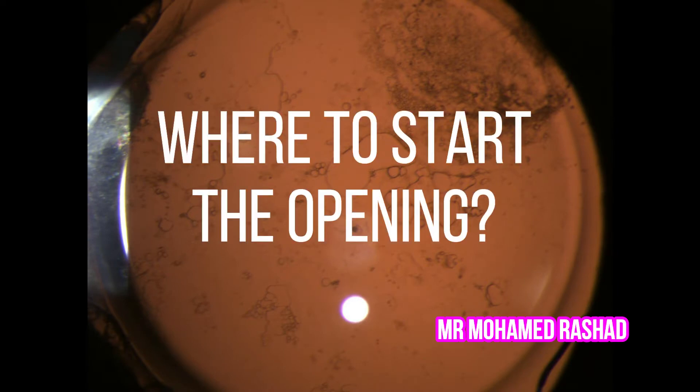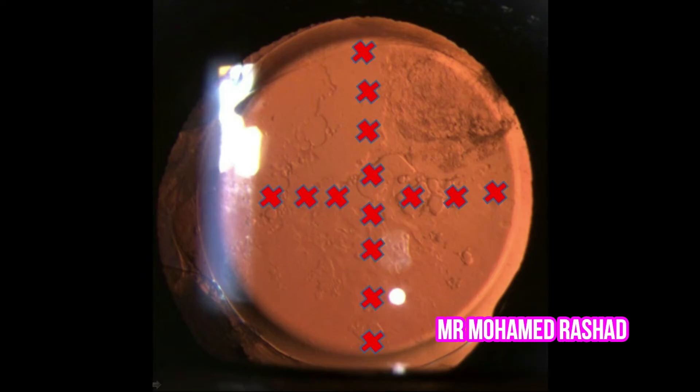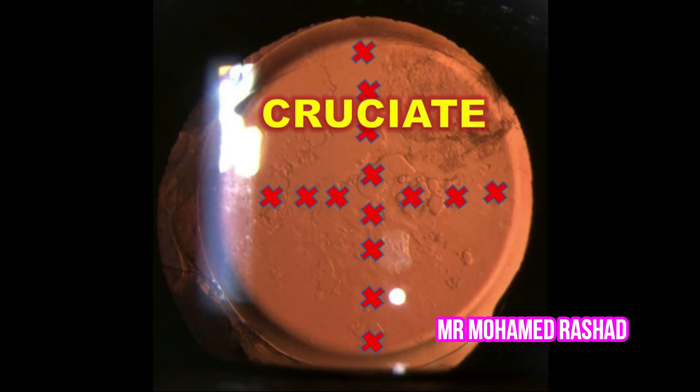In my opinion, the easiest way to do an opening in the posterior capsule is by doing a cruciate opening. You start at 12 o'clock and pull down to 6 o'clock, thereby avoiding pitting of the intraocular lens. This gives you an opening that is in the center, and then you enlarge it on both sides from the center to the periphery.